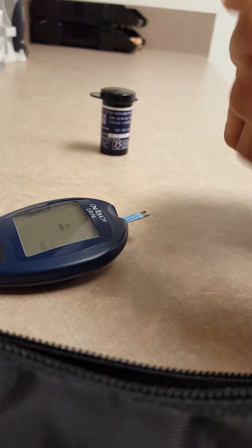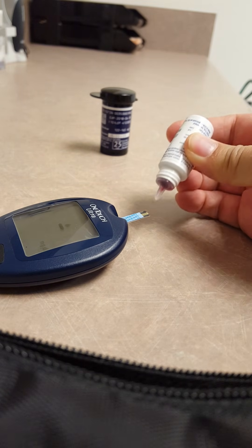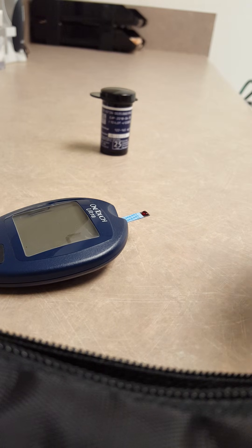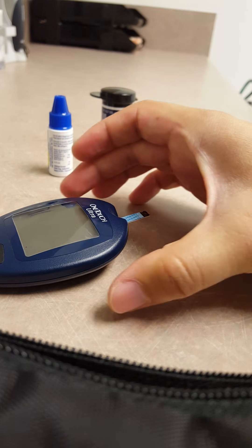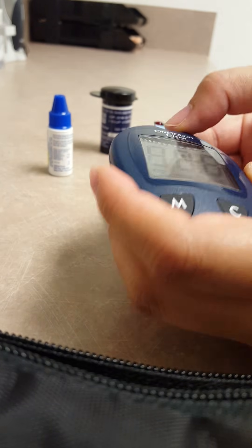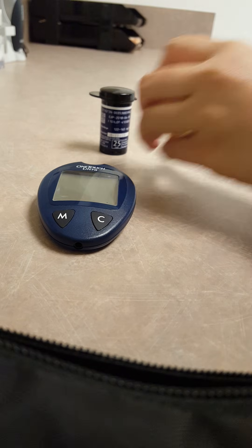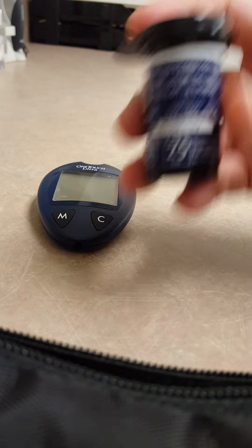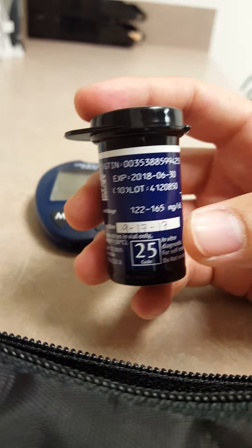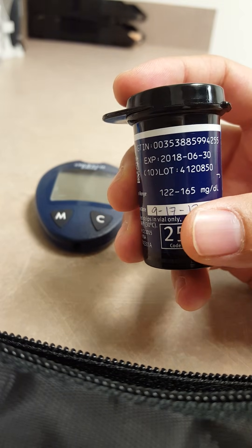You're going to apply that drop into the test strip. It's going to count down — five, four, three, two, one — and give you the result. I always take the test strip out. The result is 146. You're going to write that down and check: is it within the range you are expecting? It is between 122 and 165, so that's what you expect.